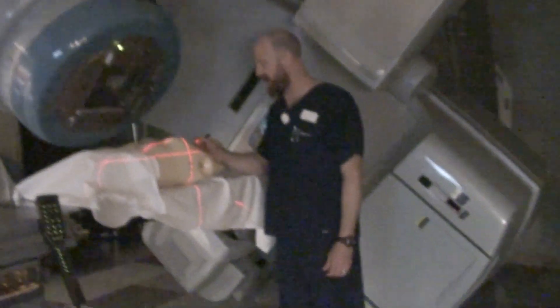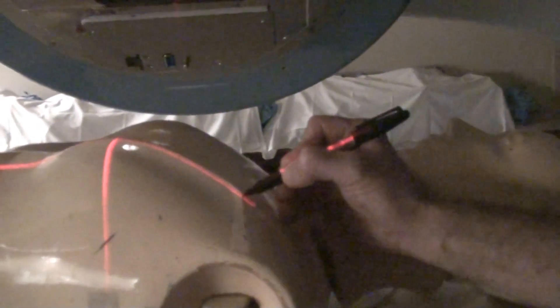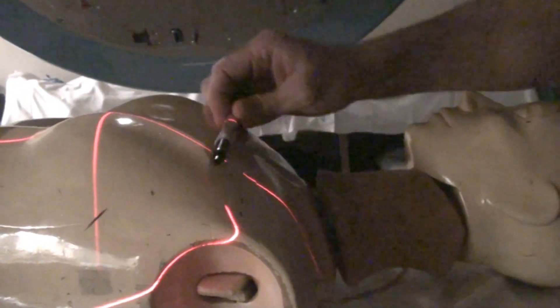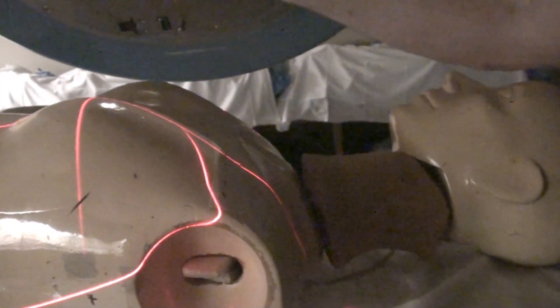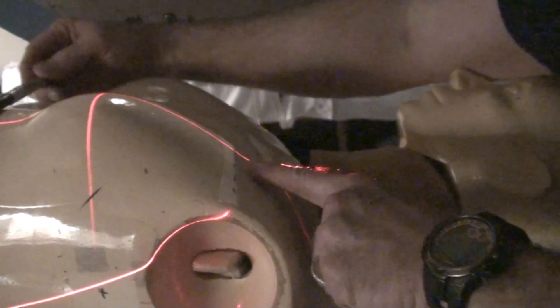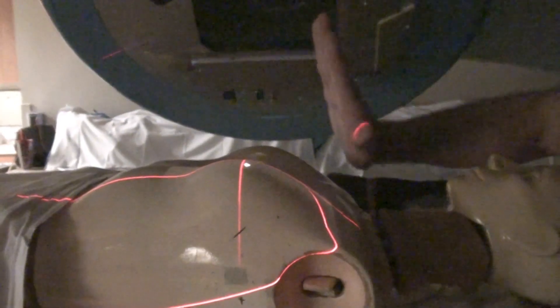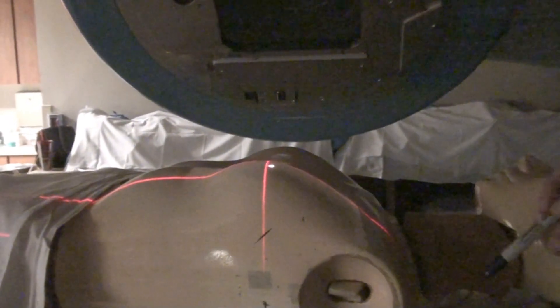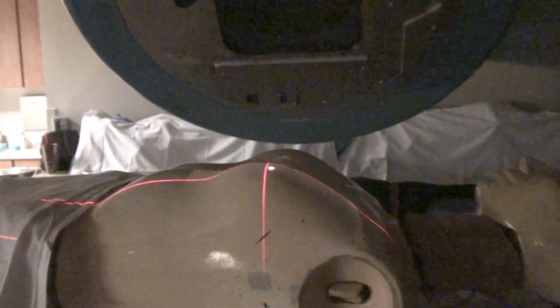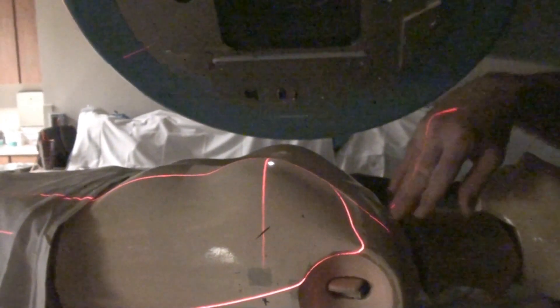If you come right over here, you'll be able to see that the superior edge of the beam actually diverges. Instead of being flat, you can actually see that angle of divergence from the superior edge of the beam. Obviously, you can see the beam is larger here than it is up there. You have divergence on the superior edge - the Y1 section of that beam. So you've got a divergent field, both inferior and superior. That's going to become important when we start matching beams together if you have to have a supraclavicular treatment for this particular person.